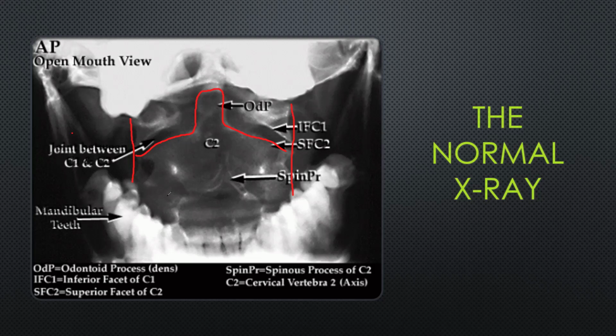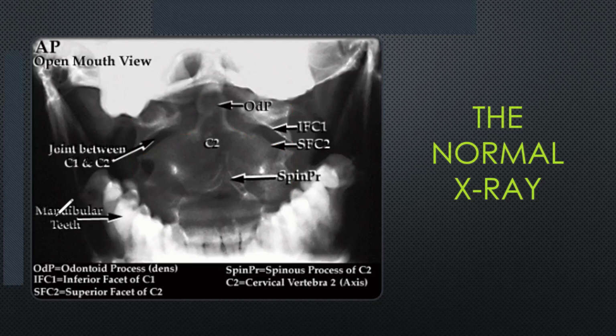Although we don't see that too often in an emergency setting, it's something you may find. But the most important thing is pain on the C-spine and an inability to rotate past 45 degrees in both directions or one direction, which should point you to doing a C-spine X-ray on the patient. Now that we know what we're looking for, it becomes quite easy to look for abnormalities.